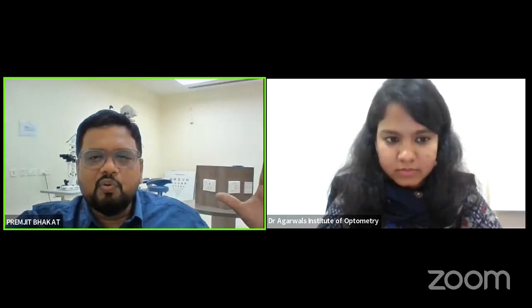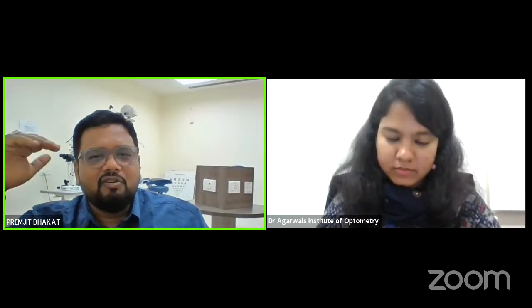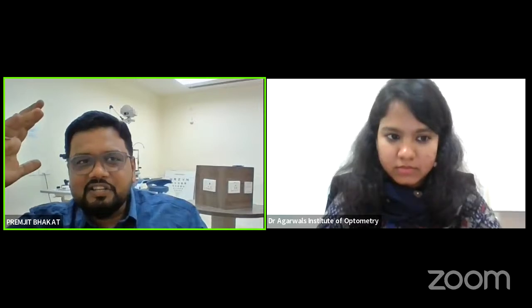Consider someone who has long working hours, who comes to the office at 8 o'clock and goes at night at 8 o'clock, or removes the lenses by 9 or 10. That means average wearing time is 12 to 14 hours, and they work in air conditioning. Those are the cases. If you examine and see hypoxic changes at the end of the day, or the patient is not comfortable, a silicone hydrogel is the choice.